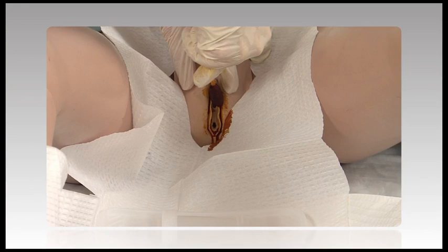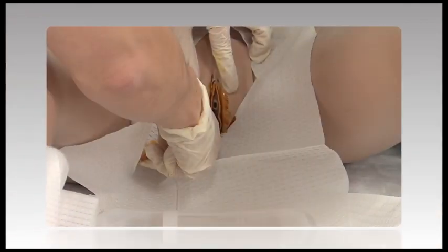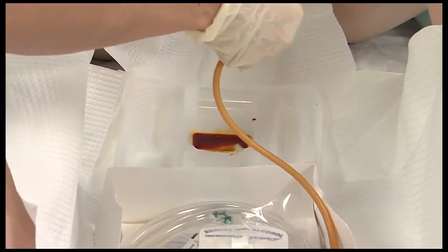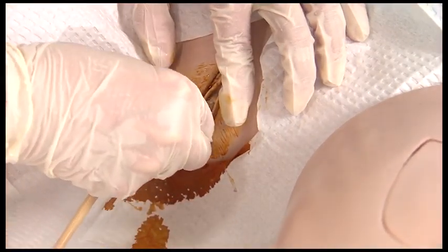Use the first swab stick to cleanse the labia minora furthest from you with a downward stroke and discard. Do the same with the labia minora closest to you. With the last swab stick, cleanse the middle area between the labia minora. Remove the catheter from the lubricant. Insert the catheter into the urethral meatus, using gentle pressure until urine is seen in the drainage tube.